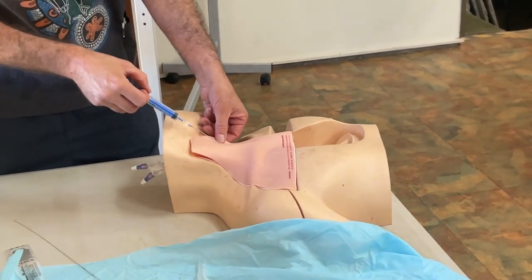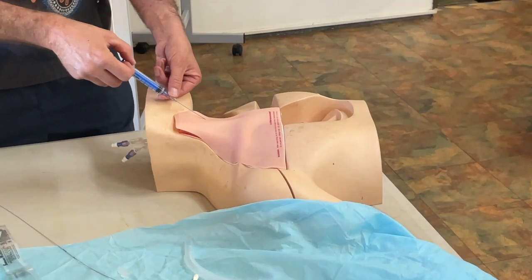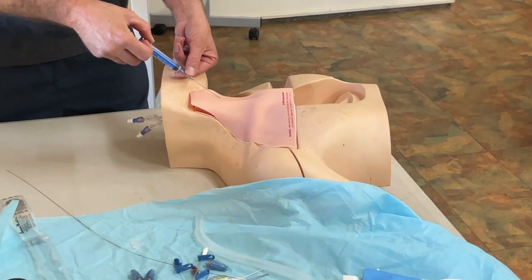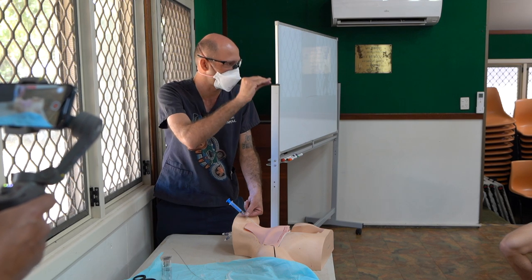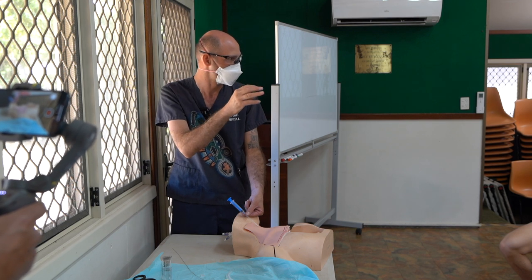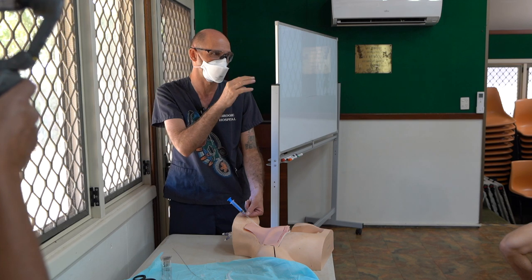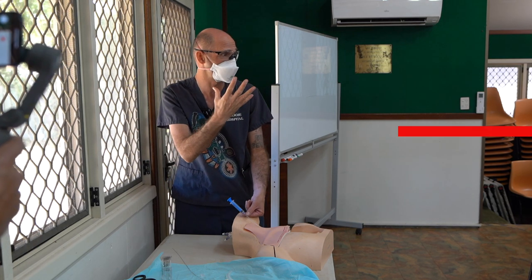Now I've got a problem — I'm looking up at the ultrasound screen and the vein should be easy to see as a big black hole, but it's a bit dehydrated and every time I push on it that vein is collapsing. It is a big vein, but it can be quite easy to close on itself if they're a bit dry. So, any tricks to blow the vein open and get the needle through?